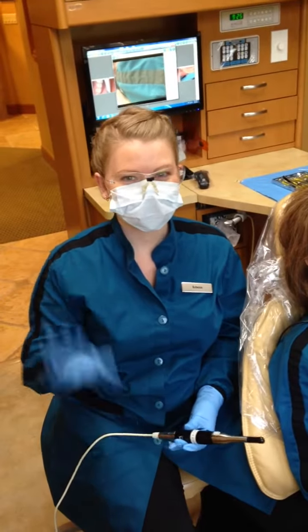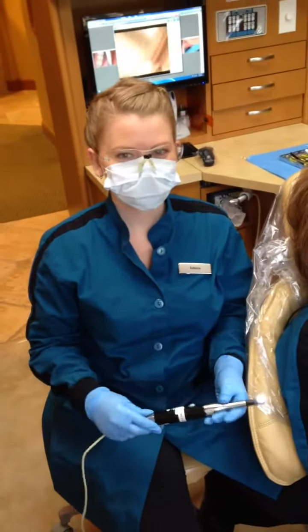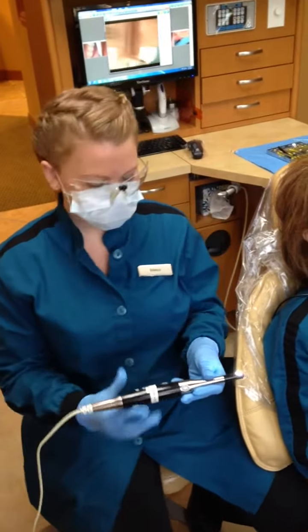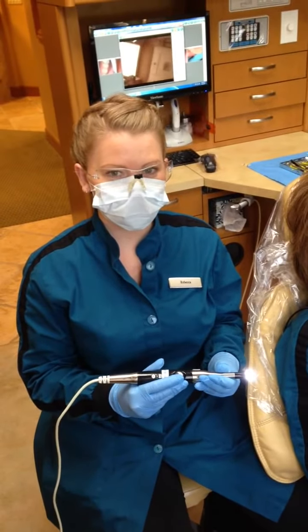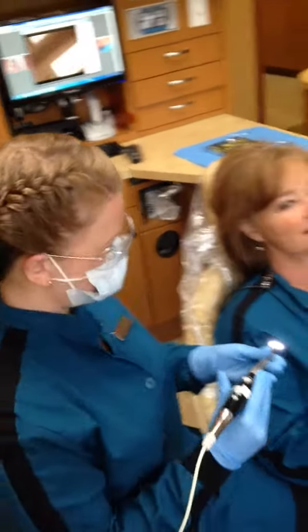The office is having fun and we have Rebecca and Debbie, who's going to be our lovely patient. Rebecca's going to demonstrate the intraoral camera. We use it to go inside the patient's mouth and take pictures of their teeth so that they can see what we're seeing. Great, let's see how this magic thing works.